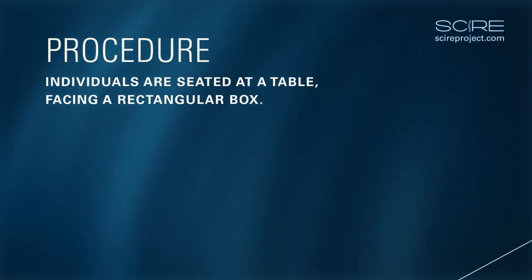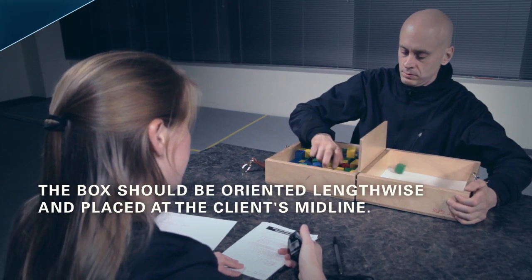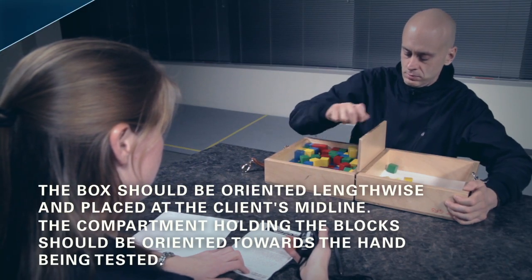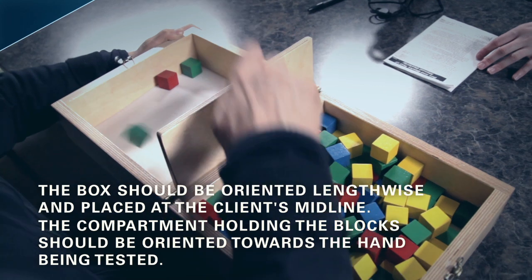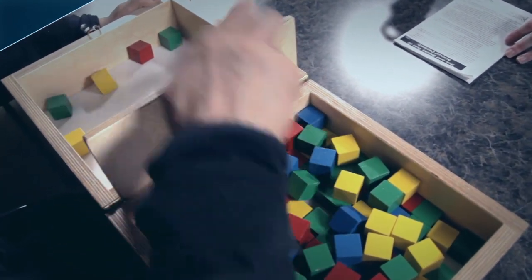Individuals are seated at a table facing a rectangular box that is divided into two square compartments of equal dimension by means of a partition. The box should be oriented lengthwise and placed at the client's midline, with the compartment holding the blocks oriented toward the hand being tested. All the wooden cubes or blocks are placed in one compartment or the other.